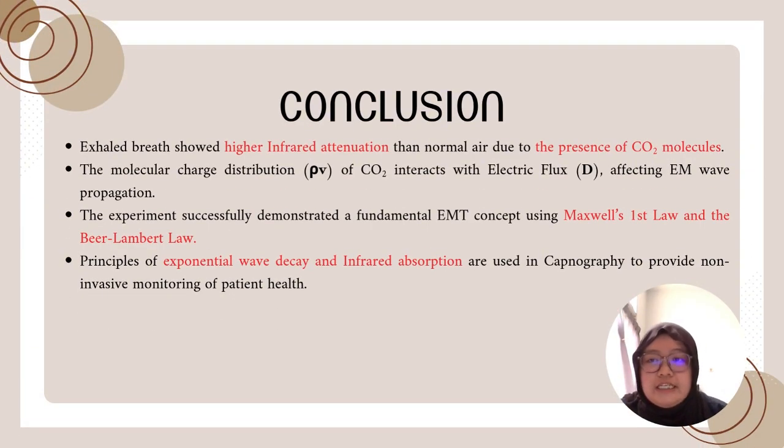In conclusion, the exhaled breath shows a higher infrared attenuation than normal air due to the presence of carbon dioxide molecules. The molecular charge distribution of carbon dioxide interacts with the electric flux, which affects the electromagnetic wave propagation. The experiment successfully demonstrated a fundamental EMT concept using Maxwell's first law and the Beer-Lambert law. The principle of exponential wave decay and infrared absorption are used in capnography to provide non-invasive monitoring of patient health.